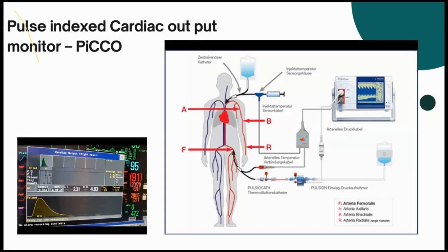Because we take this out rarely, we use it for selective patients, because you need to go for an invasive femoral line also. We don't use it for each and every patient. One thing is it is expensive, and sometimes we can manage with the minimally invasive equipment.